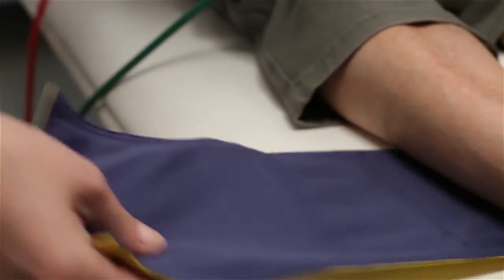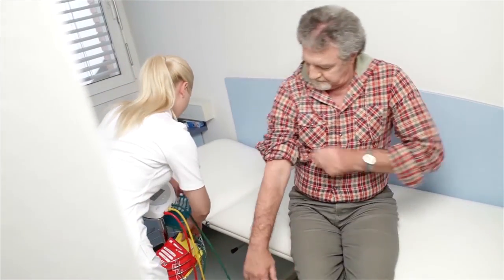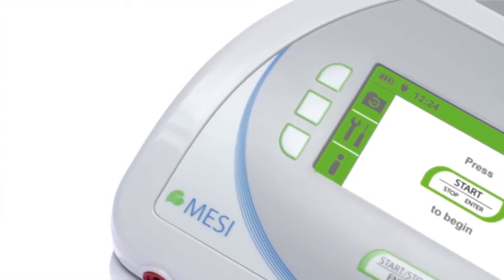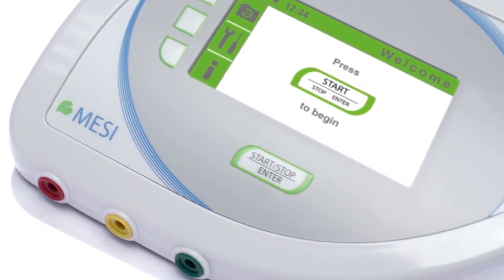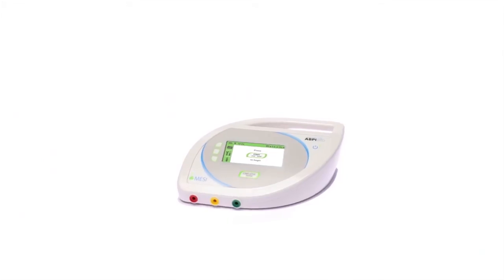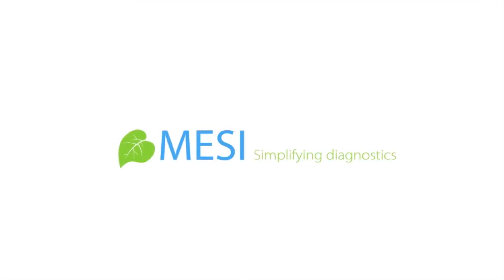Diverse examination rooms are not a problem for ABPI MD — its portability has been enhanced with its convenient design and long-lasting battery. The MESI company follows the 'simplifying diagnostics' motto to support your work, assist you with accurate results, and reduce the time needed for diagnosis. MESI — simplifying diagnostics.